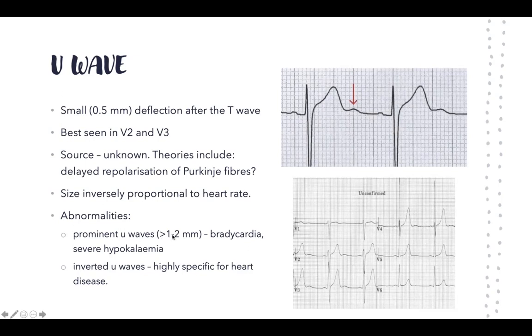If the U wave is more than one to two millimeters, it can be a sign of bradycardia or severe hypokalemia. Inverted U waves are highly specific for heart disease in general. On the ECG shown, you can see the U wave following the T wave — in some areas it's quite large, more than two small boxes, and is considered prominent.